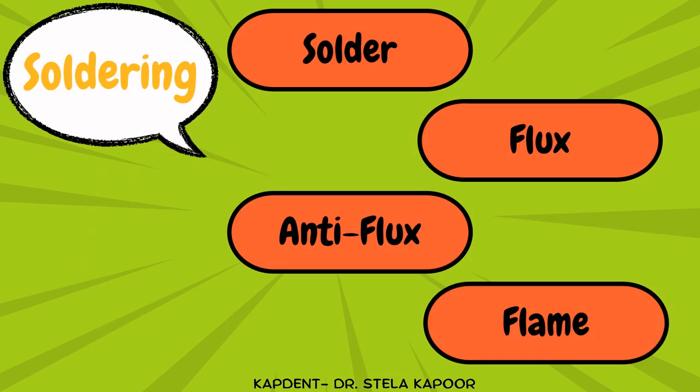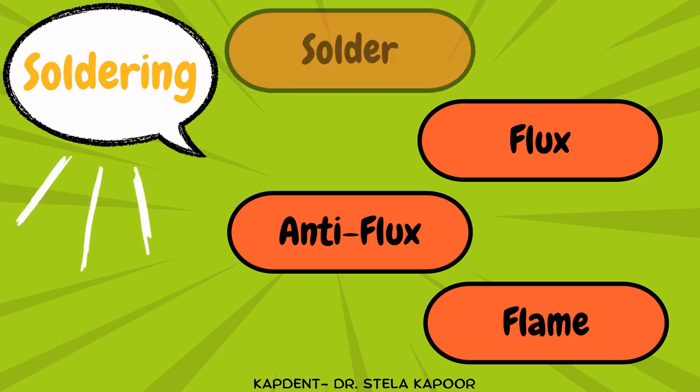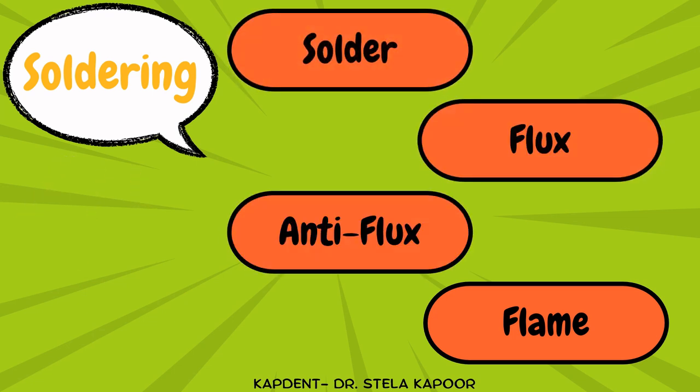Starting with the technique of soldering. In order to join two surfaces by using a third metal, you need four materials: first is the solder, second is the flux, third is the anti-flux, and fourth is the flame.